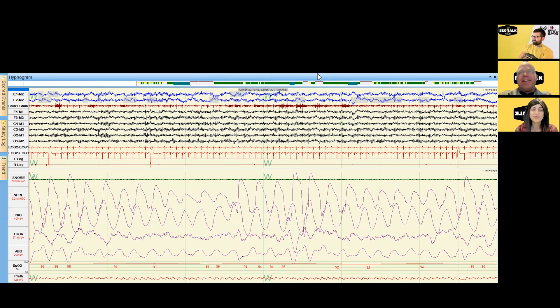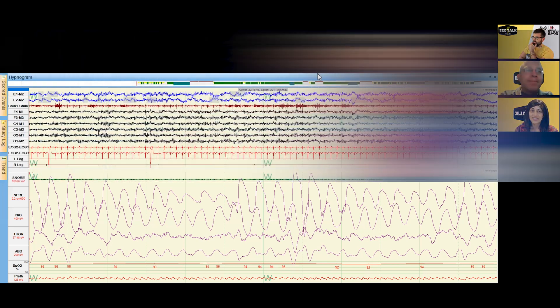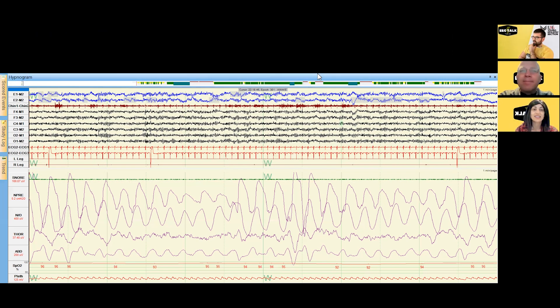Absolutely, I'd be happy to help. This is a baseline polysomnogram — a baseline sleep study, often abbreviated as PSG. What we're looking at here is one night of sleep in the sleep laboratory.